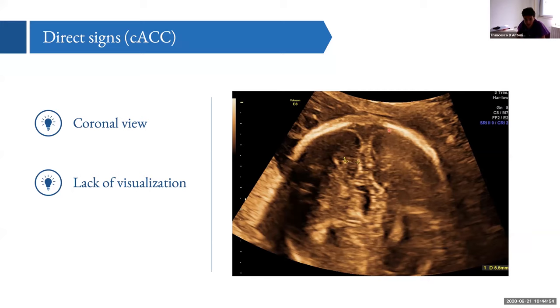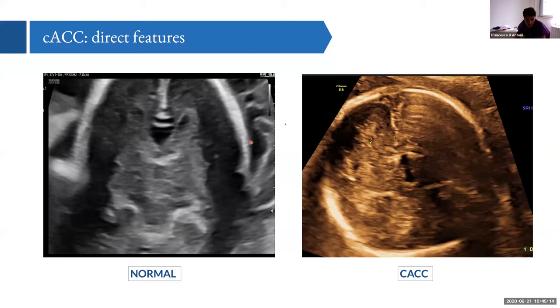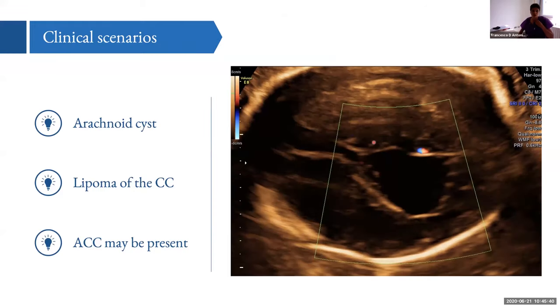To confirm the diagnosis, a coronal view can be obtained, showing absence of the cavum septum pellucidum, no anechoic structure representing the corpus callosum, and lateral displacement of the frontal horns from the interhemispheric fissure. Comparing a normal coronal view — showing interhemispheric fissure, corpus callosum, cavum septum pellucidum, and lateral frontal horns — with an ACC case confirms these findings clearly.